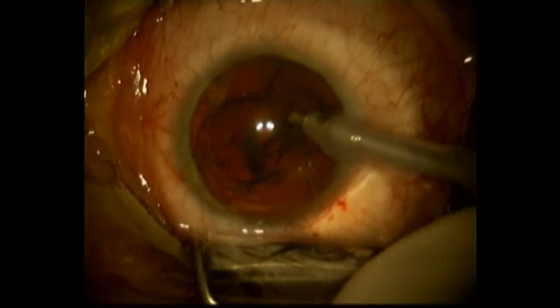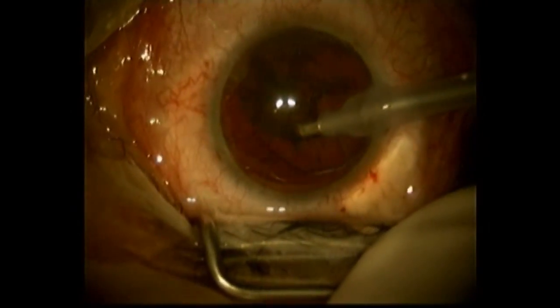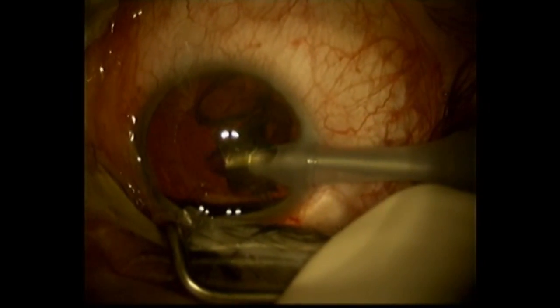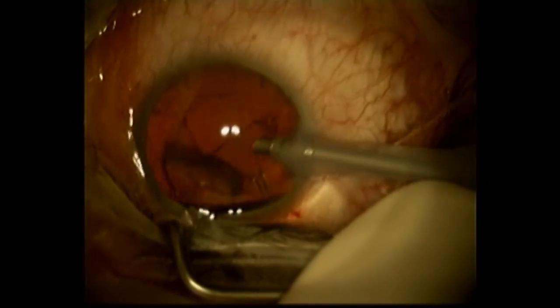That's hydrodissection right there. Removing the cataract with phacoemulsification — this is an ultrasonic technique to remove the cataract. It doesn't take very long because it's a relatively soft cataract. I'm protecting the capsule and cornea, just dissolving and removing the lens nucleus and cortex.